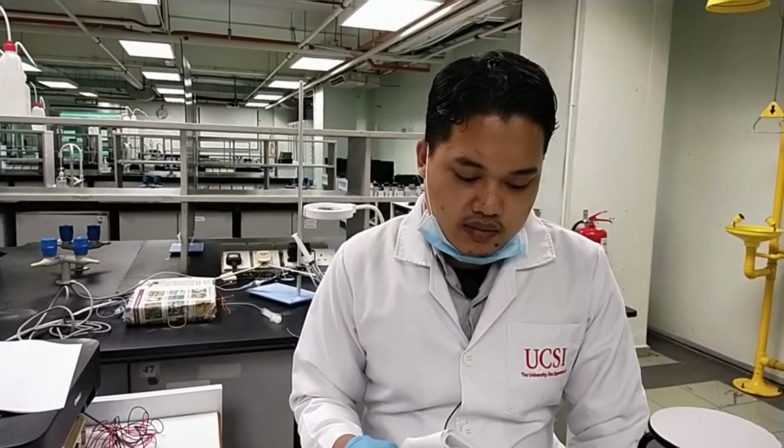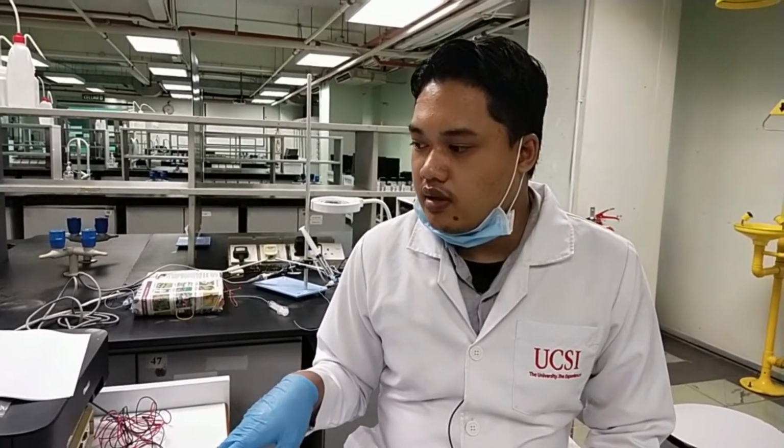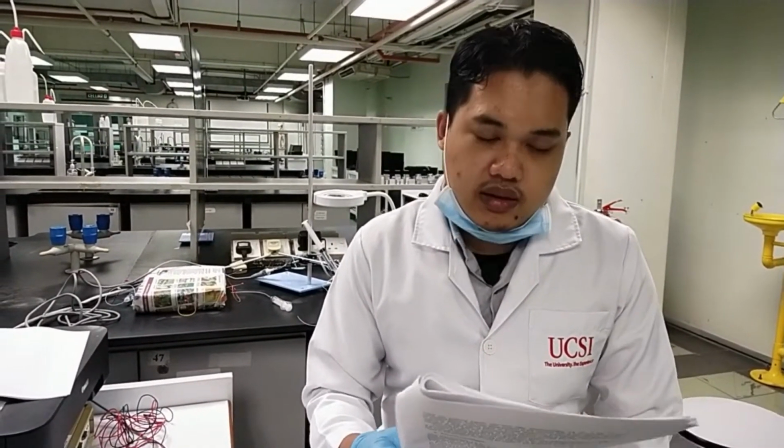For the first part, we are going to calibrate the BioPAC system here. The BioPAC system is already calibrated using the setting required for blood pressure monitoring. The second part is the cannulation, where we prepare the rats and isolate a few things: the jugular veins, the carotid artery, the vagus nerve, and we also need to isolate the trachea.